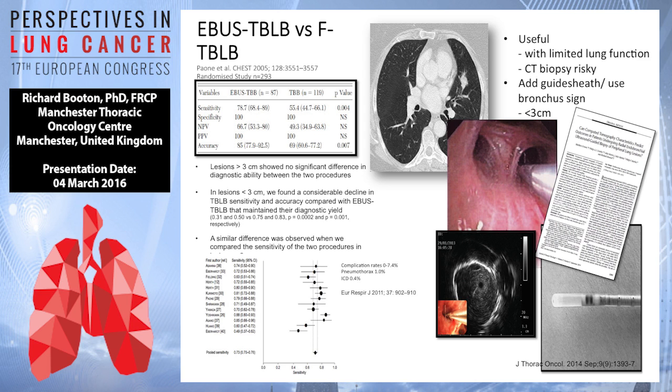The beauty of this technique probably is that in small samples, 2 or 3 centimetre tumour sizes, your success of biopsying with these techniques is much greater. And this is just a graphic to illustrate, small tumour, close to the bronchial tree, but not quite sure if your bronchi are getting there. You can pass the probe down selective segments, see these pictures, and then if you've got a nice circumferential ultrasound image, the chances of getting a representative biopsy for this are very high, up in the 90s, and with minimal chance of a pneumothorax.